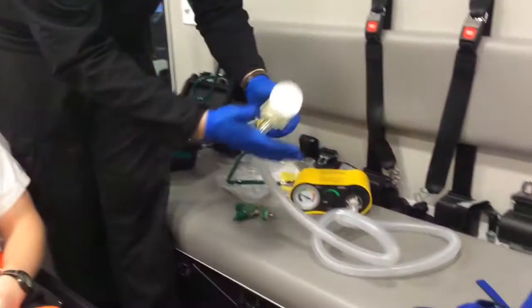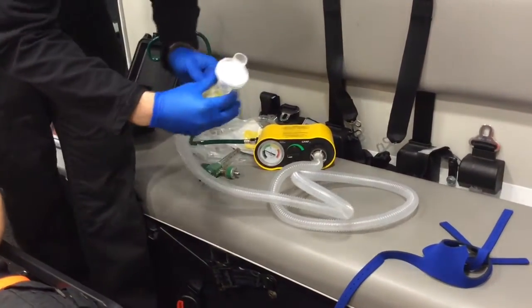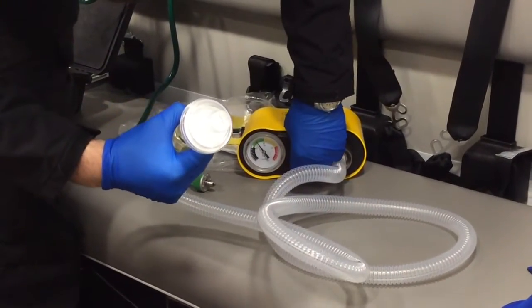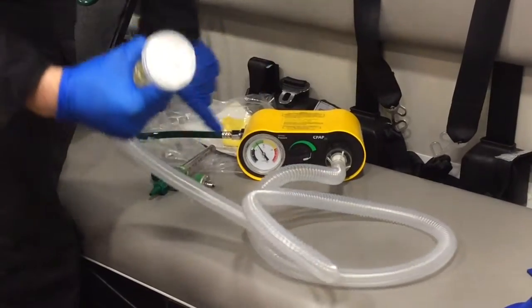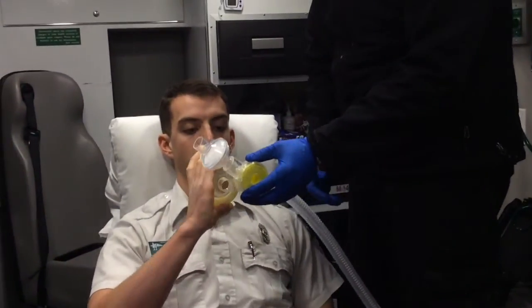We now turn on the CPAP. We grab and cover the hole with our hand, and turn the device up to 5 centimeters of water pressure. It should be in the middle of the green. We then apply it to the mask and the patient.